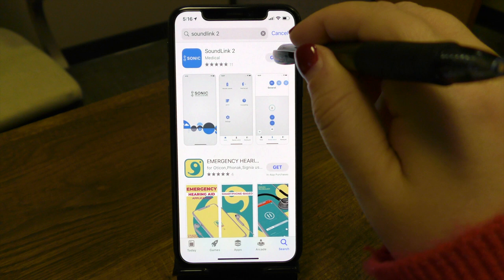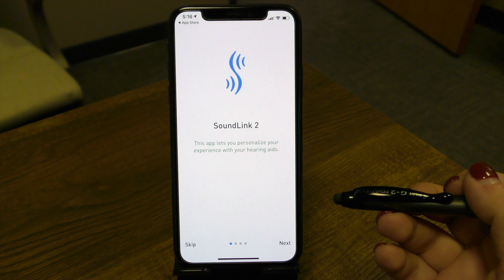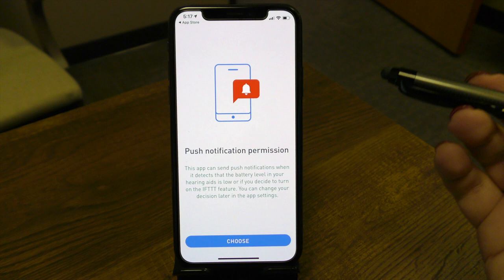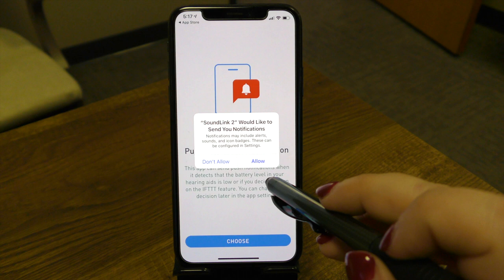Now that we've downloaded the app, let's go ahead and open it from the open icon here. This brings us to the intro of our app. Because we're going to walk through this video together, I'm going to skip the intro sliders. The first screen that comes up is a push notification screen. I would go ahead and say yes — we do want to allow push notifications in case the hearing device is trying to send us any type of notification. So let's go ahead and allow that.